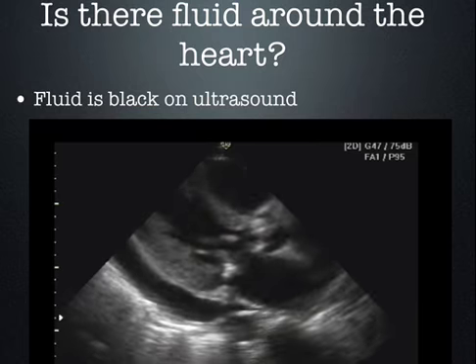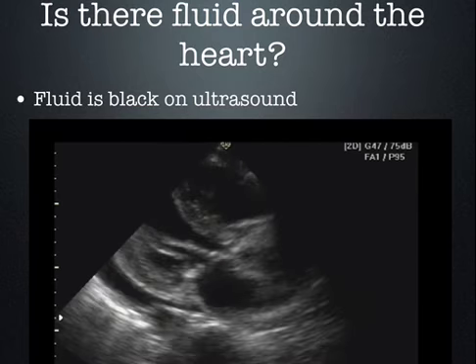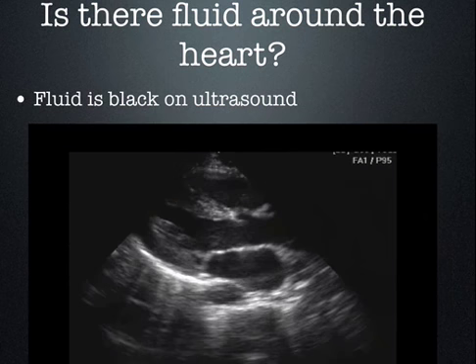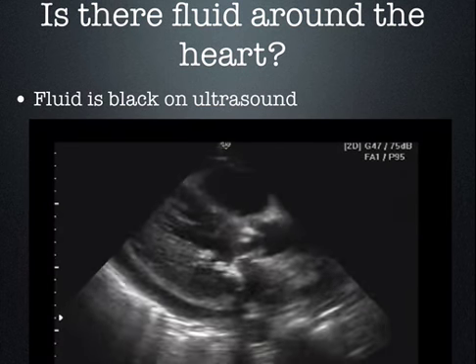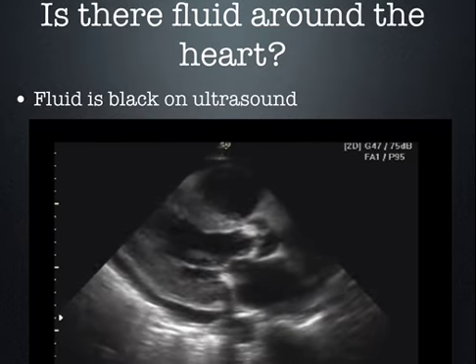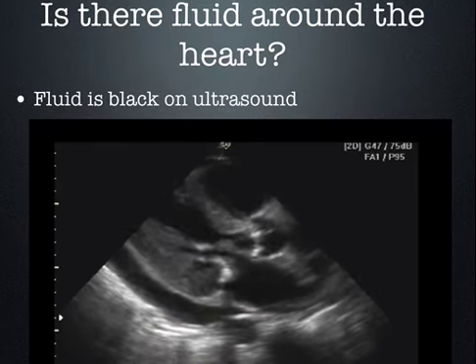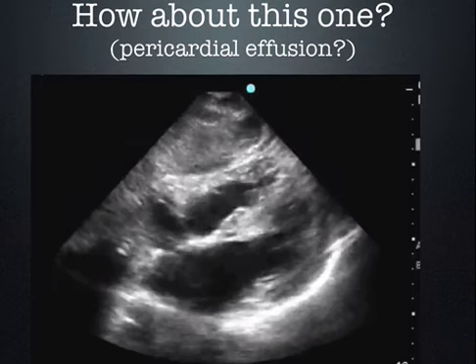Now, there's one key thing here I want you to see. You see the descending thoracic aorta right here. I didn't point that out earlier, but that's what that is. Let me back up again and activate that one. Here we go. Descending thoracic aorta. That fluid is dissecting between the left atrium and the descending thoracic aorta. That is 100% a pericardial effusion, as opposed to another image I'll show you in a moment.